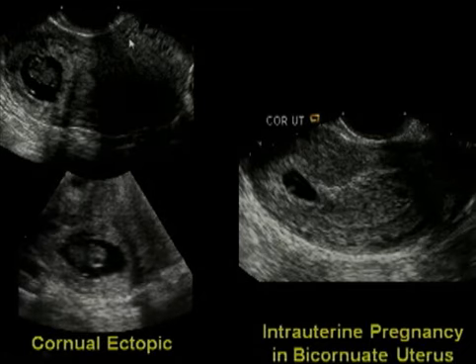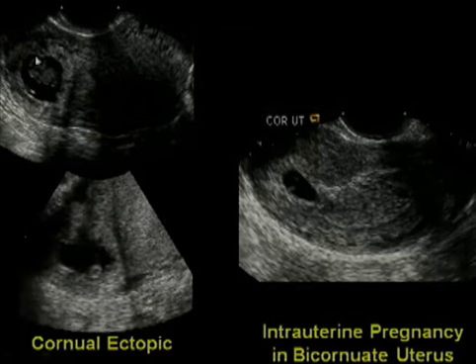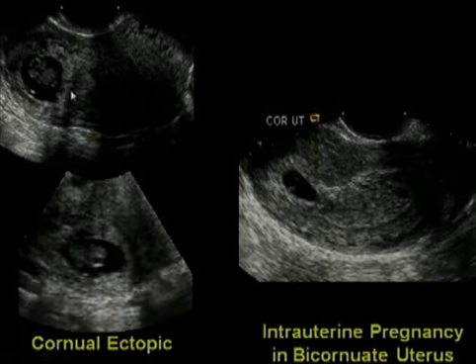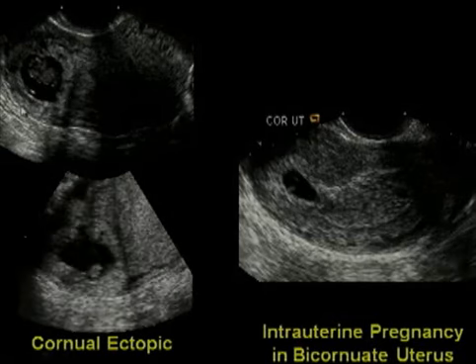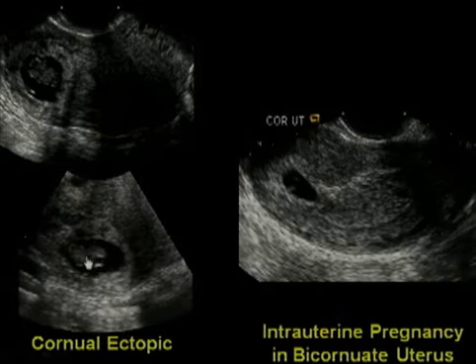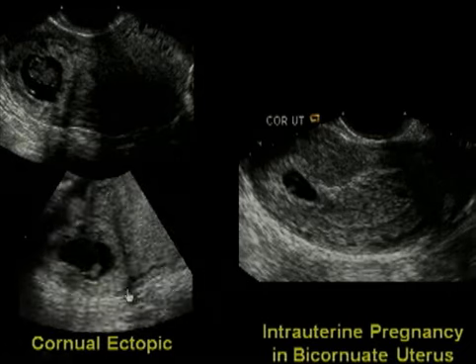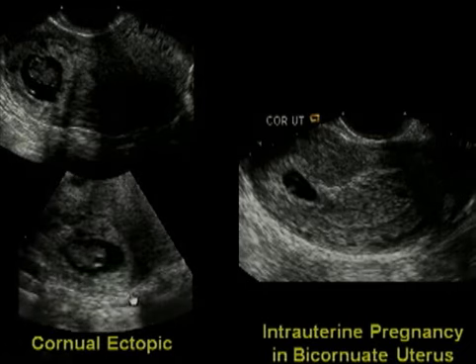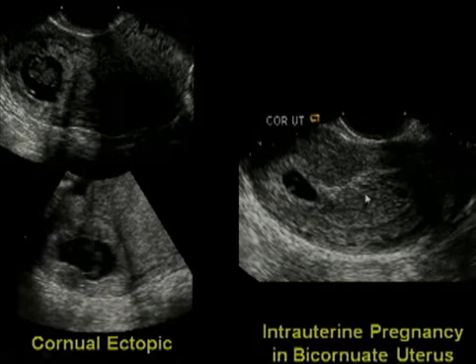Here's the uterus. The pregnancy is way off to one side. There's bright tissue around it, but then there's no dark myometrium around the outside. And we see it again here. There's the heartbeat, there's the main body of the uterus, there's bright tissue around it, nothing around the far edge. That's a cornual ectopic pregnancy.